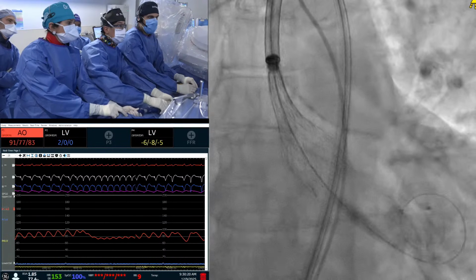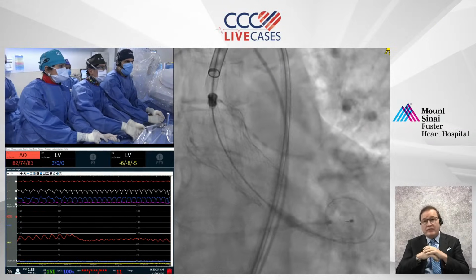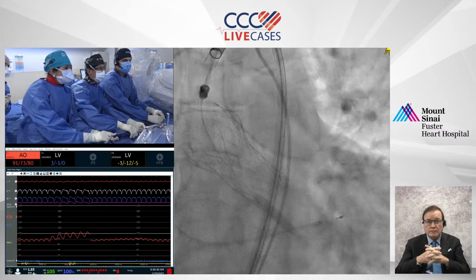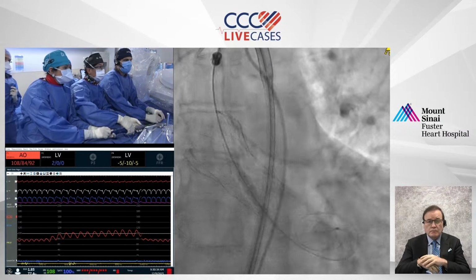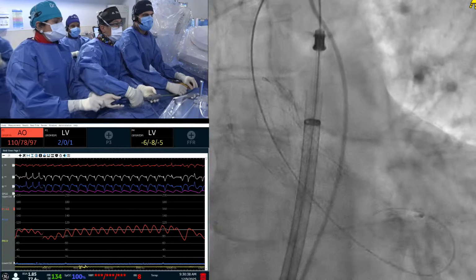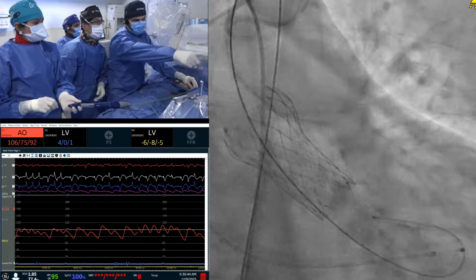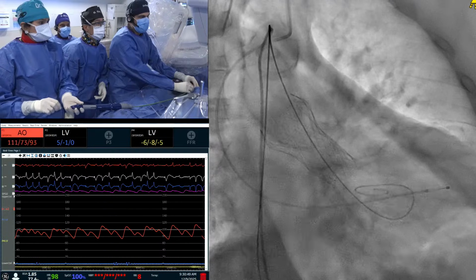Also, while deploying, we have another question. What will be the strategy if we have concomitant mitral valve disease? Very good point. Push the wire a bit. It has been shown that once you have concomitant mitral disease, you usually take care of the aortic first, and then after a few months, and we have many patients now who come back for the mitral, and mitral is only the clip because other devices are in the process of getting approved. But the tendineae is very complex.